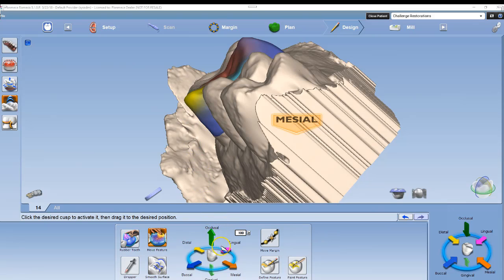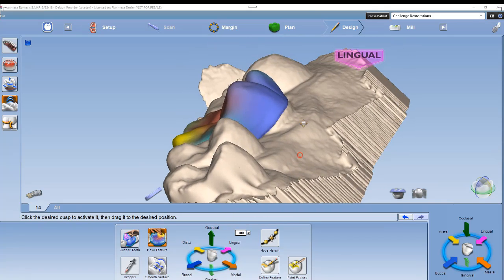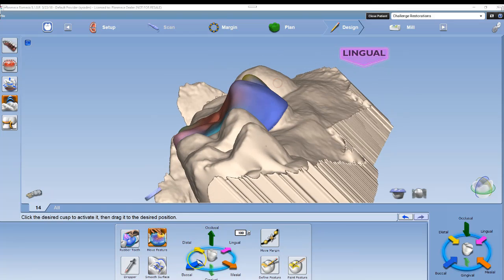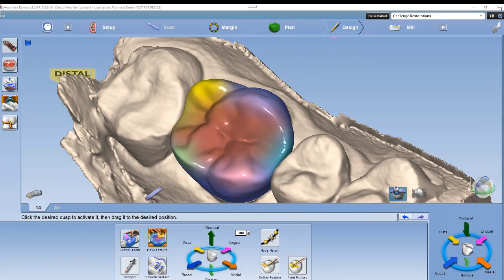I like to use it when a cusp tip is kicked out — I'll use the directional arrows to adjust. If I want to adjust the buccal cusp tip in, I will left-click the lingual arrow. If I want to move the lingual cusp tip in, I'll left-click the buccal arrow.